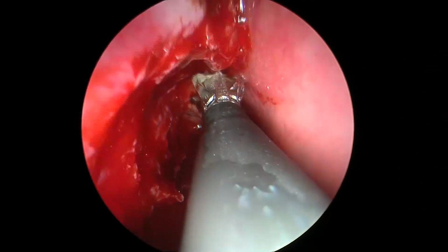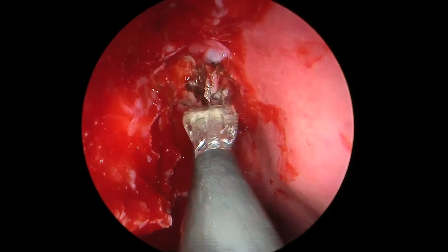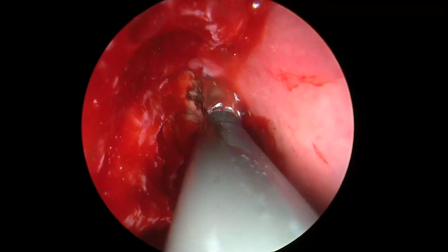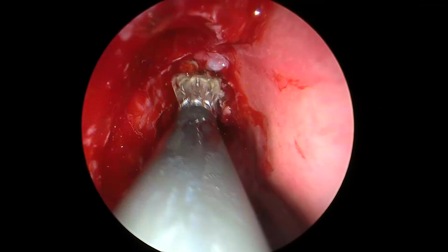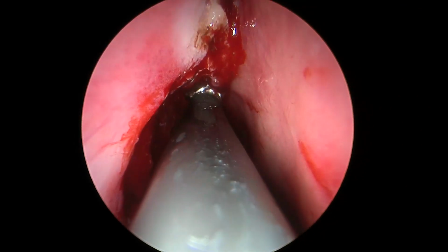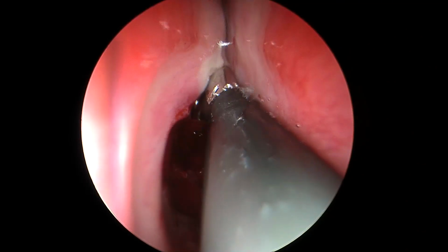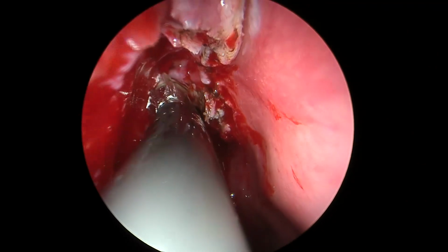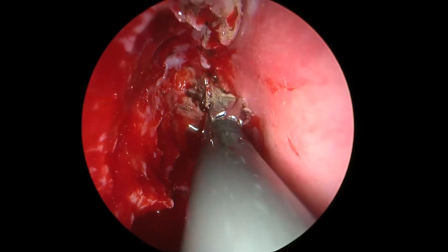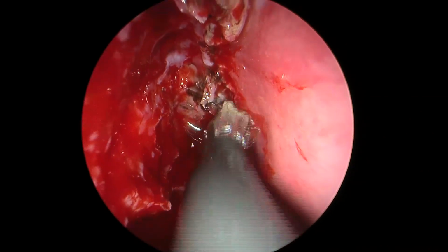Now you can see the defect region. We are using a coblator. This is a ProSize Max wand which we are using not just to coagulate the actual meningocele, but we also use the ablation mode to demucosalize, denude and ablate a lot of mucosa of the cribriform plate, the anterior ethmoid, and the residual septum superiorly, because this is the way we prepare our graft bed for our fascia to settle completely.